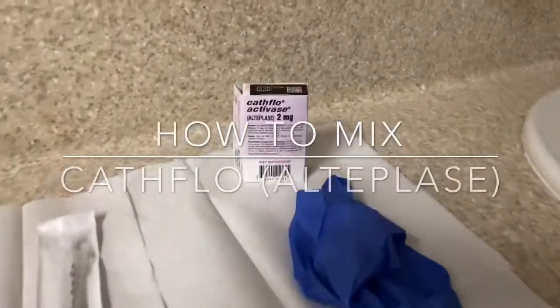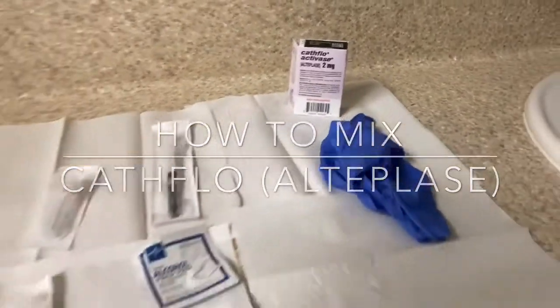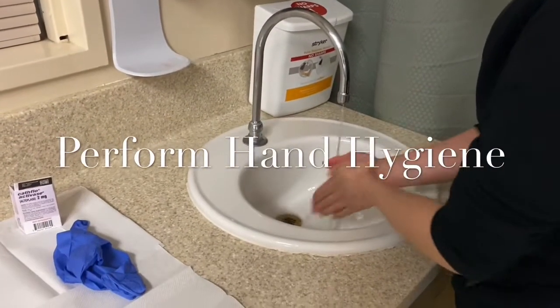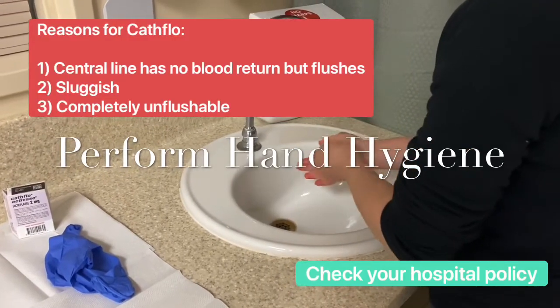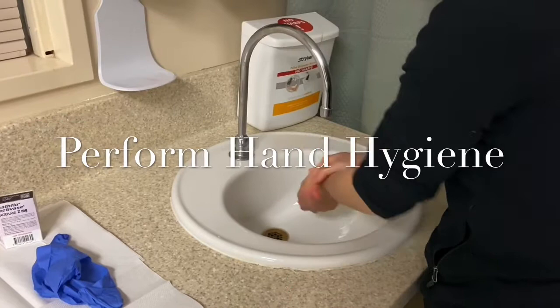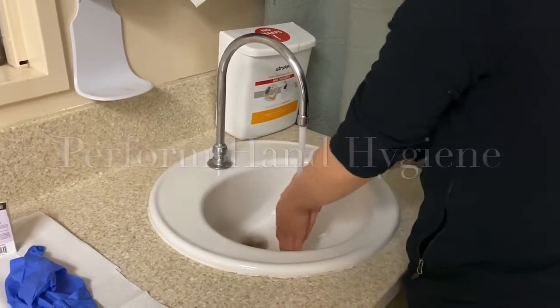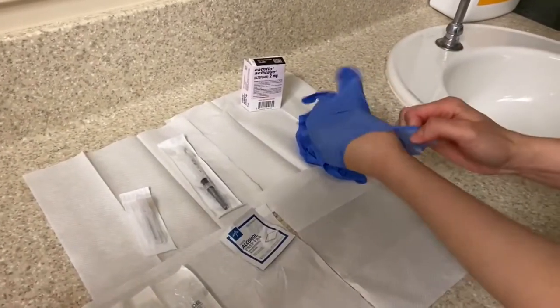Hi guys and welcome to RN Scrub. Today we're going to show you how to mix cathflow, or alteplase. While performing hand hygiene, remember that this is a medication that requires an order. It's used for a central line that has no blood return, or even though it flushes it has a sluggish blood return, or it has no blood return and isn't flushable at all.